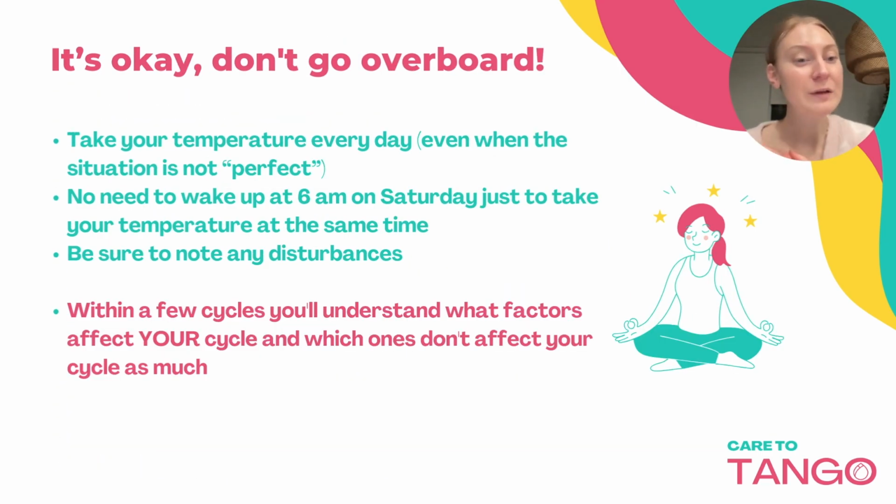So given those rules, it can sound like a lot and it can sound a little overwhelming, but it's okay. You really don't need to go overboard with it. Just take your temperature every single day, even if it's not the perfect situation. You don't need to wake up at 6 a.m. on a Saturday just to take your temperature at the same time.